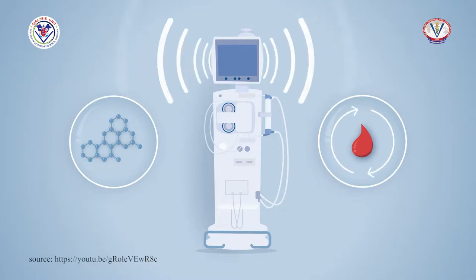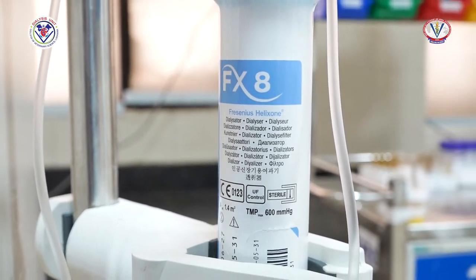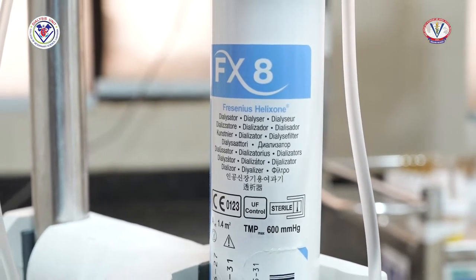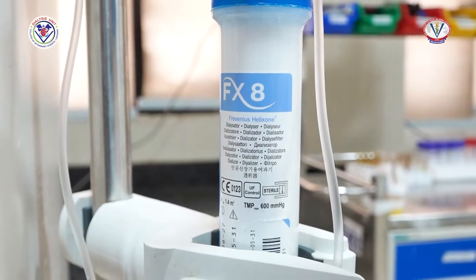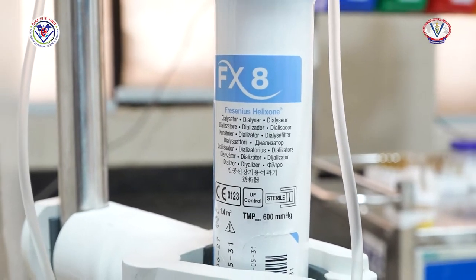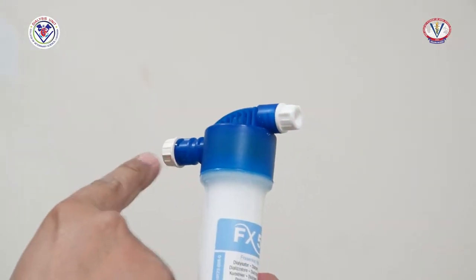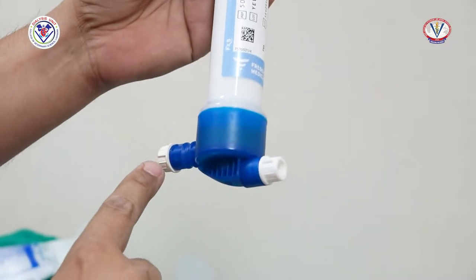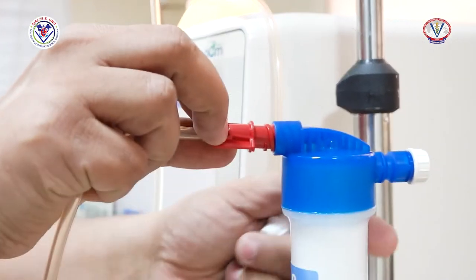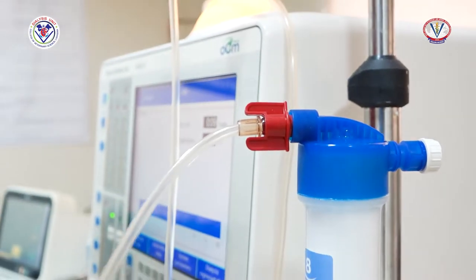circulation. The dialyzers come in different sizes based on surface area and different membrane types. Dialyzers are selected based on the patient's size and the dialyzer's surface area. Also, dialyzers can be high flux or low flux. A dialyzer has four ports, two on one side and two on the other side. These ports are connected with blood tubing and couplers, which carry blood and dialysate solution respectively.